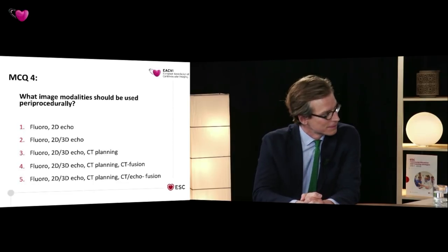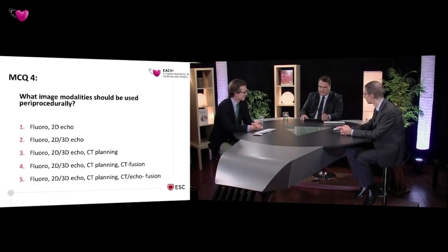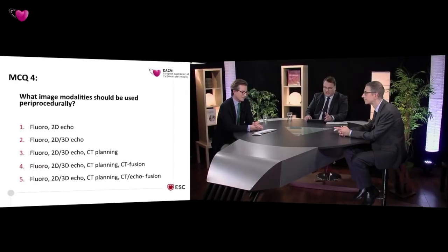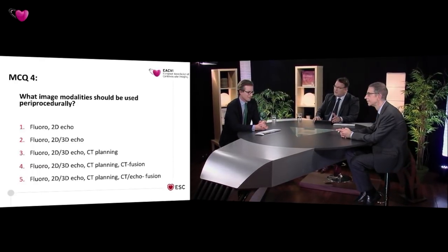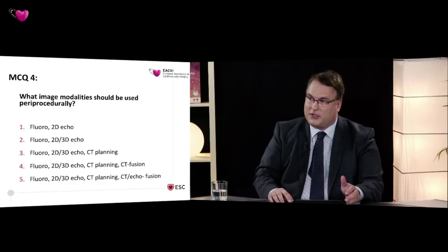I think you were very convincing, and the viewers of this webinar are actually also quite well informed. So nobody voted for fluoroscopy and to do this procedure solely on two-dimensional echo.